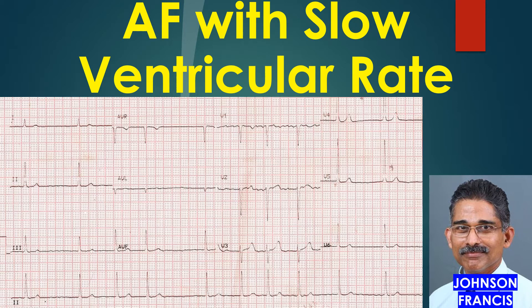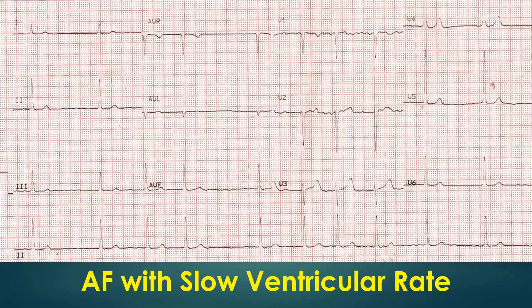Atrial fibrillation with slow ventricular rate. In this ECG, fine fibrillary waves are seen throughout the baseline, indicating fine atrial fibrillation.